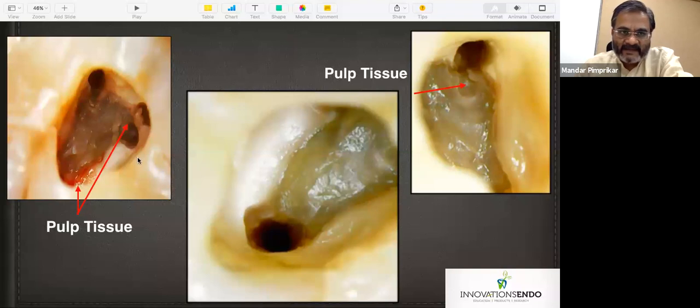If you place a few drops of hypochlorite into your prepared access cavity, the prerequisite for the access cavity would be a pre-endodontic build-up, so that your solution is contained within the prepared access cavity. Use of rubber dam is mandatory, and now with COVID-19 coming up, it will be mandatory to use rubber dam to reduce the aerosol and cross infections.